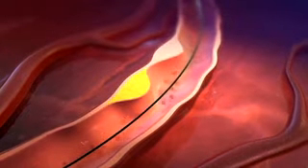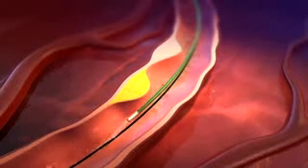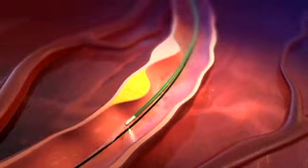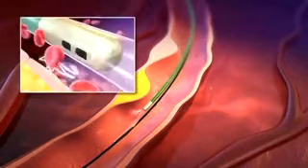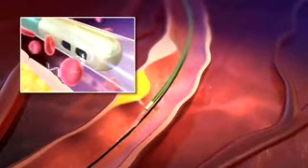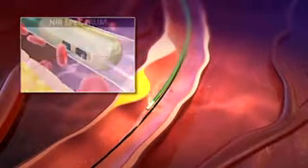The Infraredics catheter is positioned distal to the lesion over a guide wire. As the inner optical core of the catheter rotates rapidly, a pullback is performed. Near-infrared laser light is directed at the vessel wall. Some light rays are deflected by red blood cells and do not reach the lesion. Light reflected from the lesion is detected by a sensor.